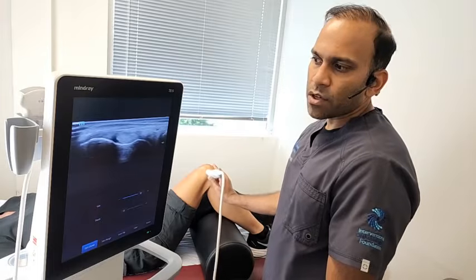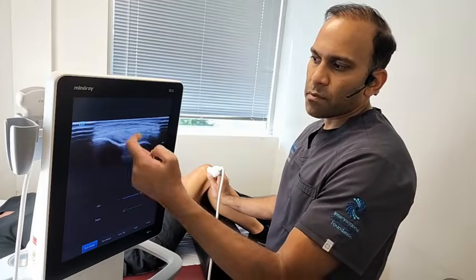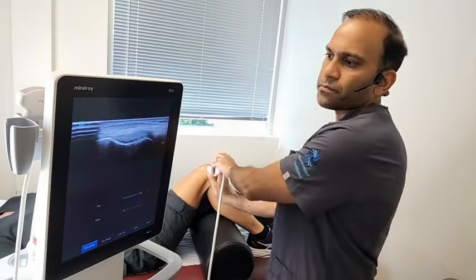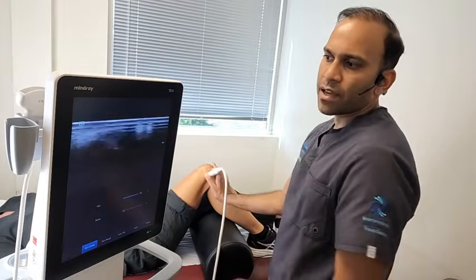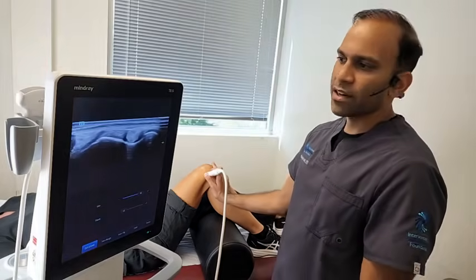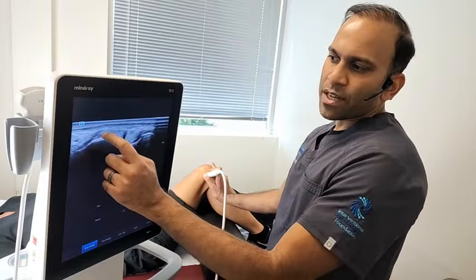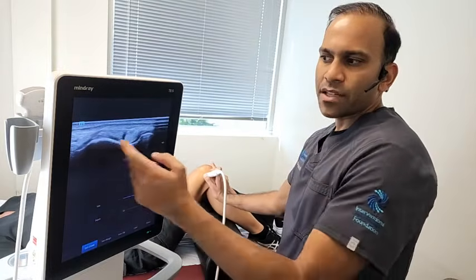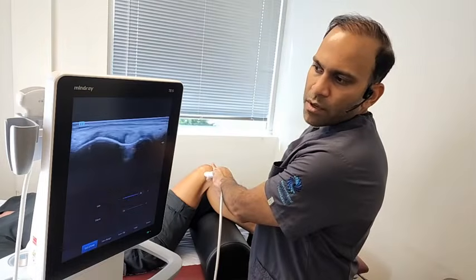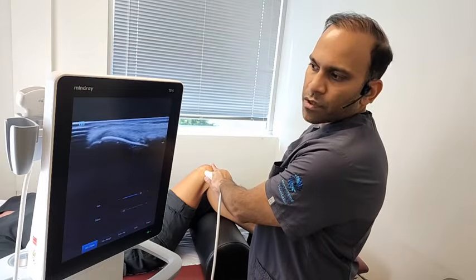For all intents and purposes, this popliteus tendon looks pretty darn good. And if I turn the probe, I can actually then see the popliteus tendon as it comes from behind the knee over here and comes and attaches onto the bone, and it looks really pretty. So back to this view of the eye of popliteus. It sounds like some kind of Harry Potter character or something. But the eye of popliteus right there, and this right here is actually where your LCL is coming and attaching. The LCL is your lateral collateral ligament, and as I turn my probe gently, you're going to see that LCL come into view like so.